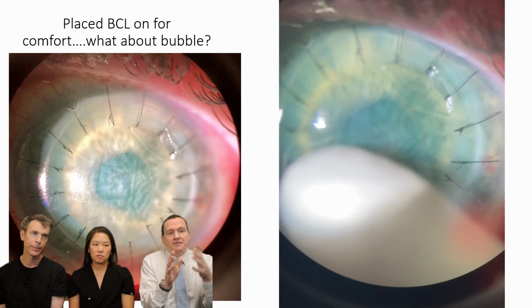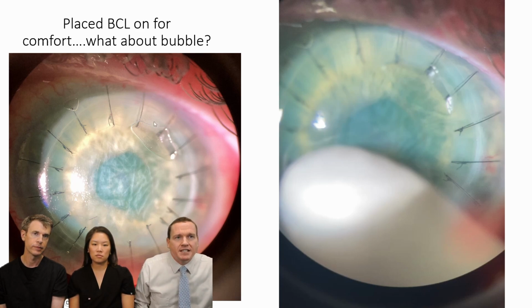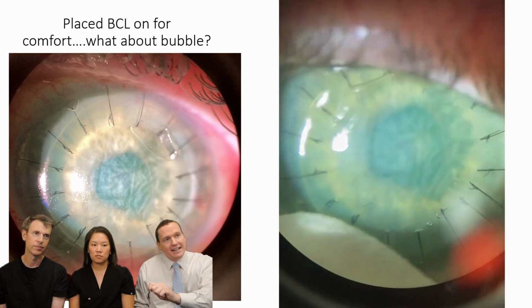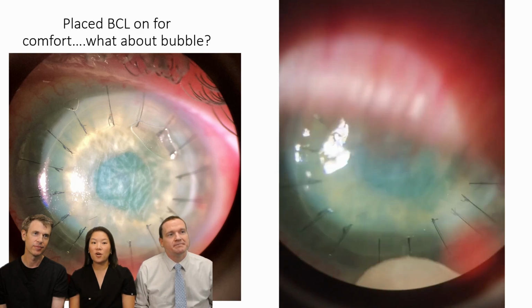The point I want to mention for contact lens is when we saw the patient, they had an irritated cornea. So a typical thing to do at a one-day post-op is put a soft contact lens on, a bandage contact lens. And the student asked me, is that normal? There's a bubble under there. Is that okay? Can I send him home like that? And if you haven't seen this trick, remember this trick. Take a little Q-tip and you can slide that contact lens off to the side and the bubble will disappear. So the answer is no, don't leave the bubble there.